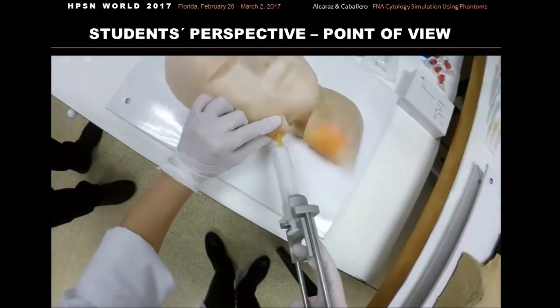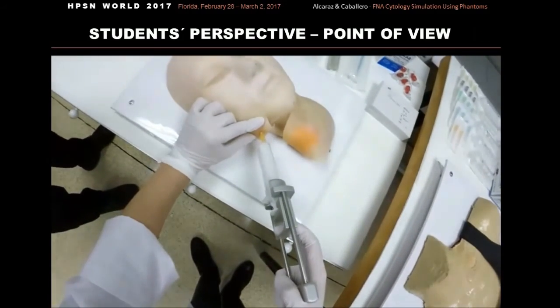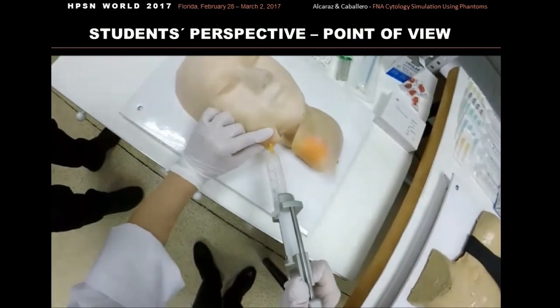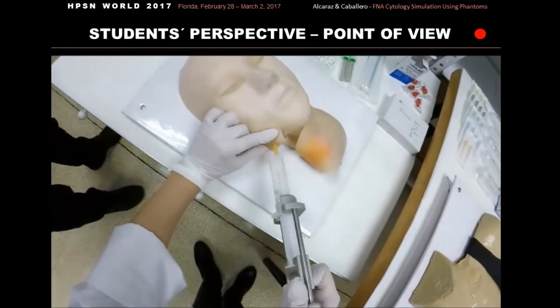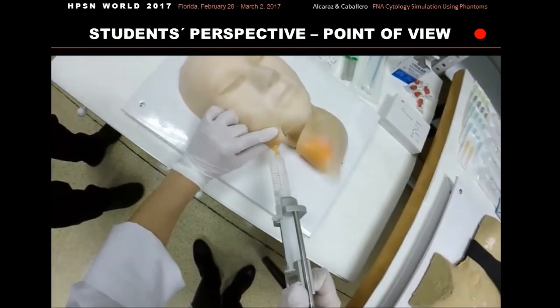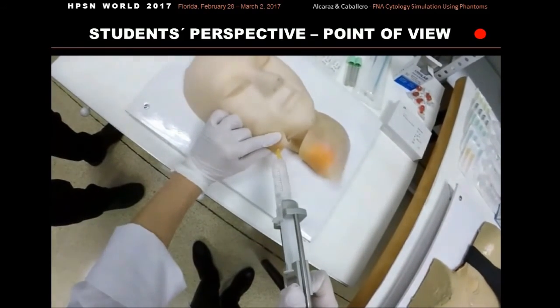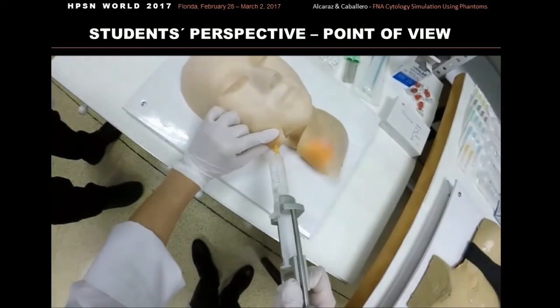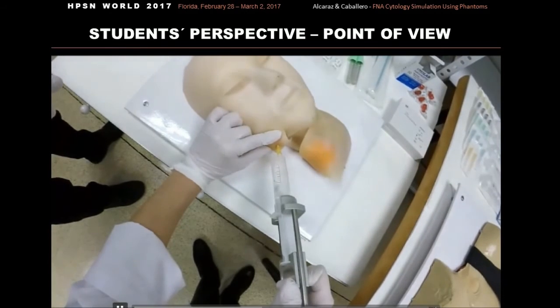And suction is applied by the syringe pulling the trigger of the Cameco pistol, like this. Now perhaps the most important part of the procedure is to move quickly back and forth inside the lesion. After a few seconds, they will see some material in the hub of the needle, and they must release the suction before the needle is withdrawn from the nodule, like this.